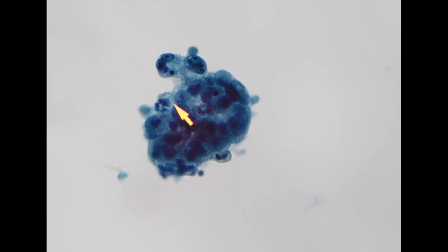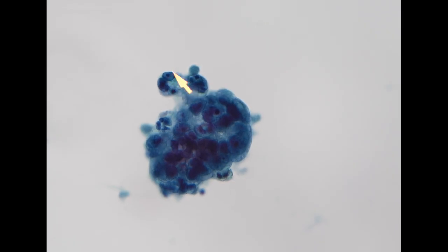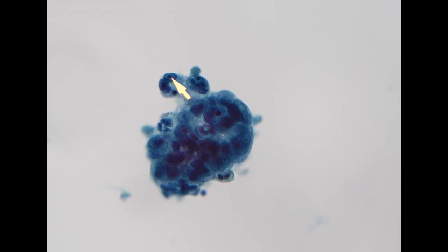So it shows typical cytological features for high-grade adenocarcinoma, including enlarged nucleus, vesicular chromatin, prominent nucleoli, and forming this tight three-dimensional architecture. Some of the cells do show bubbly cytoplasm. So this is a positive specimen and consistent with the patient's history of ovarian cancer.